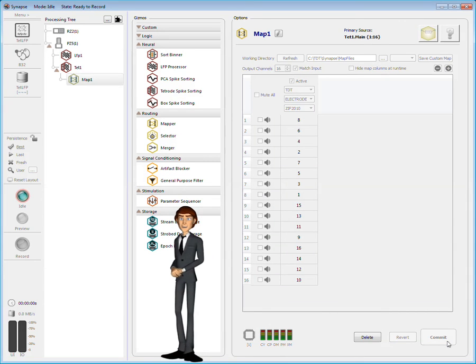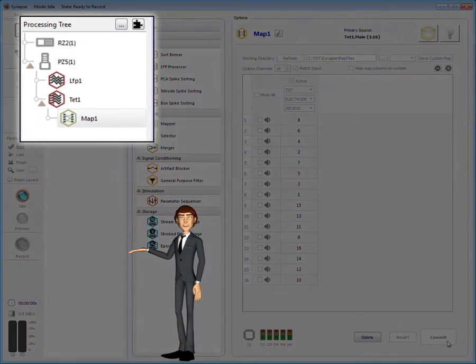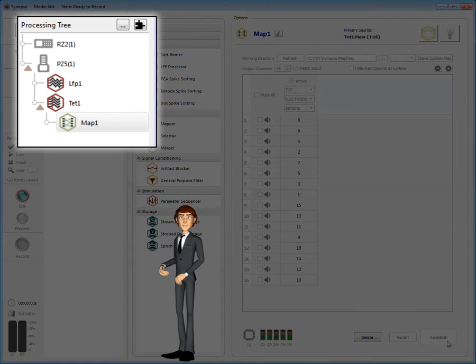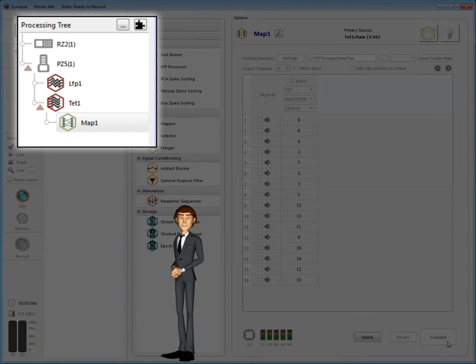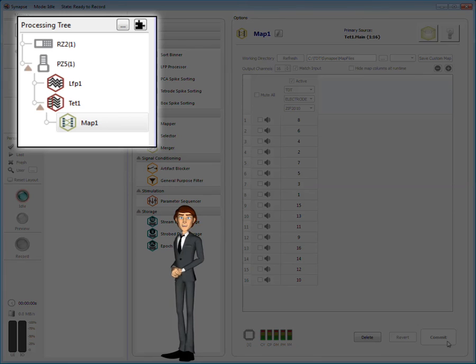With that configured, let's take a look at the processing tree. Uh oh, this is bad, very bad. Because the TetRoad gizmo was selected when I added the mapper, the mapper was added beneath, or after, the TetRoad.